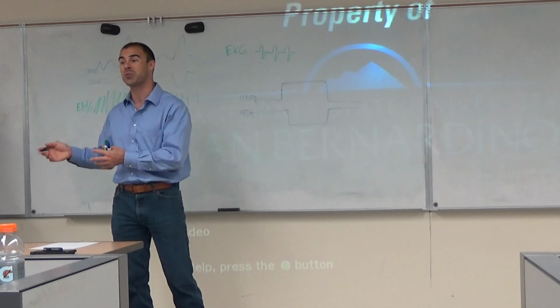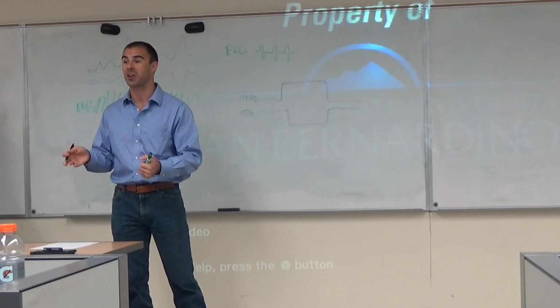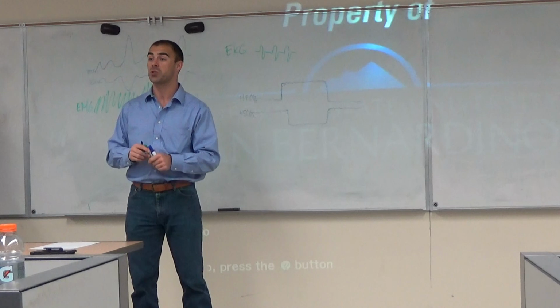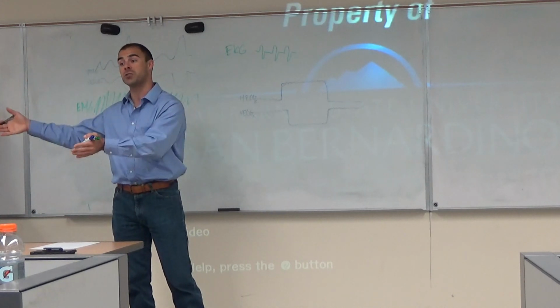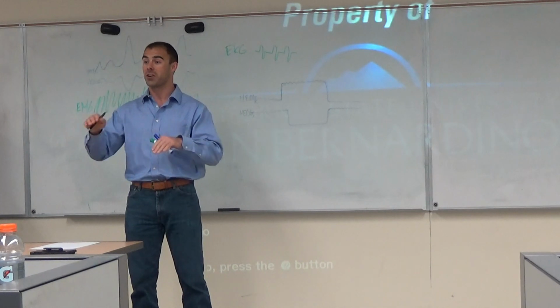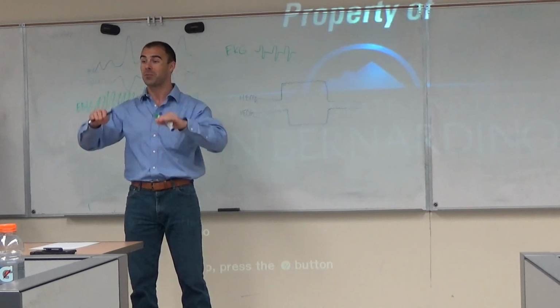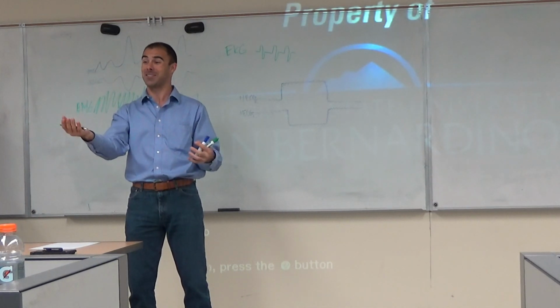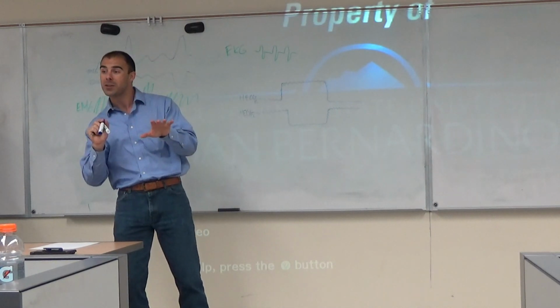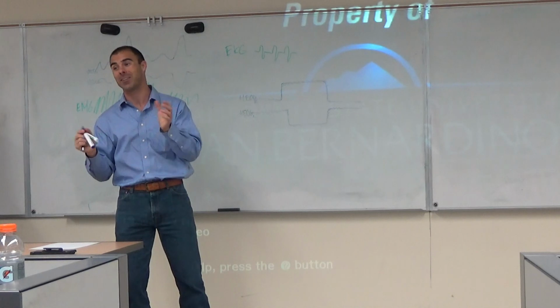Because you want to see how your manipulations in your experiment that are going to either raise or lower attention, or how your manipulations between groups of people who have ADHD or don't have ADHD, are going to affect alpha, for example. So you definitely want to keep that in there. So it can be an artifact sometimes, but it kind of depends. Like a lot in life, right?